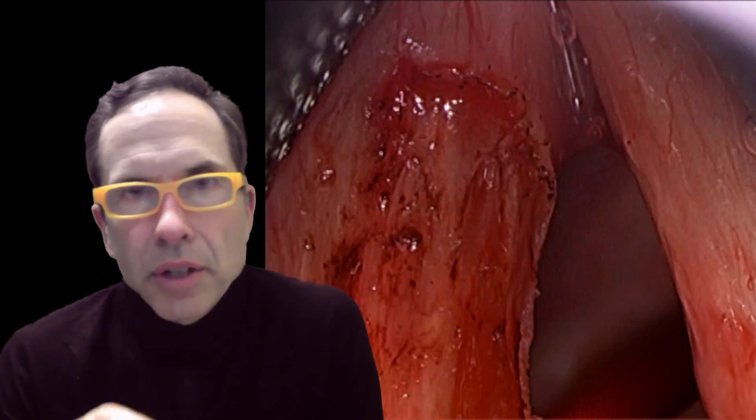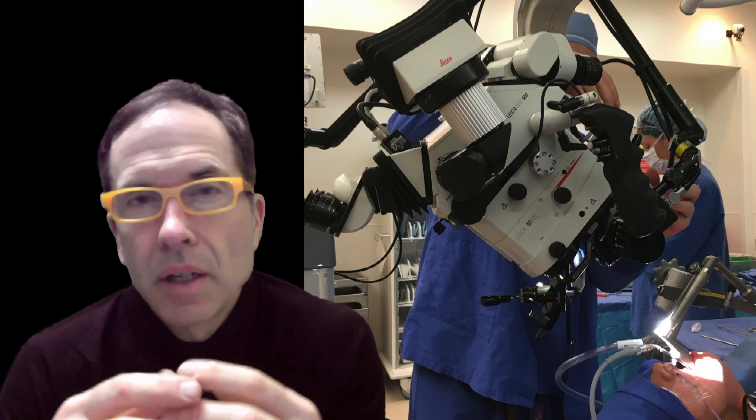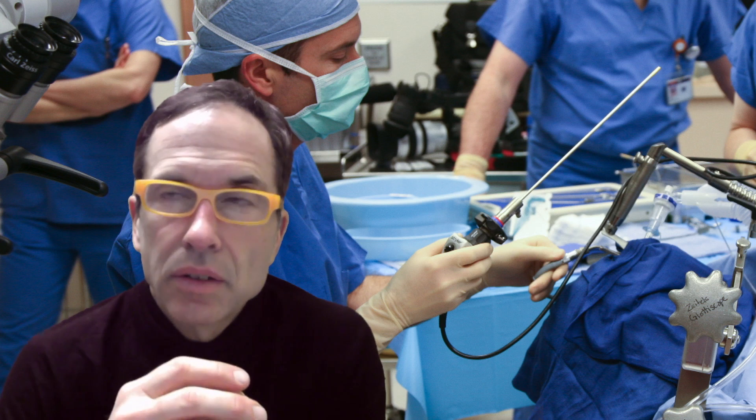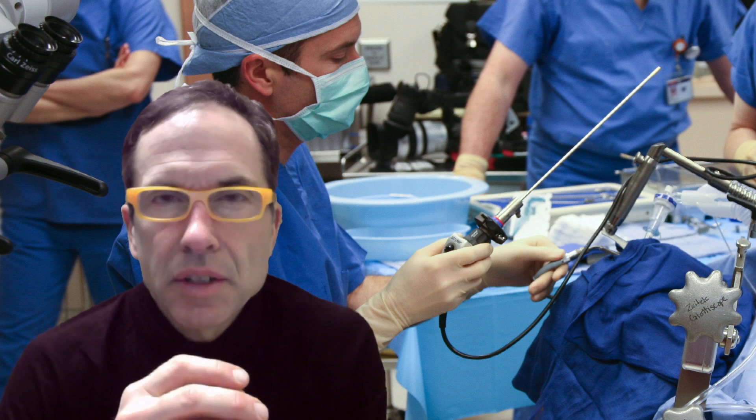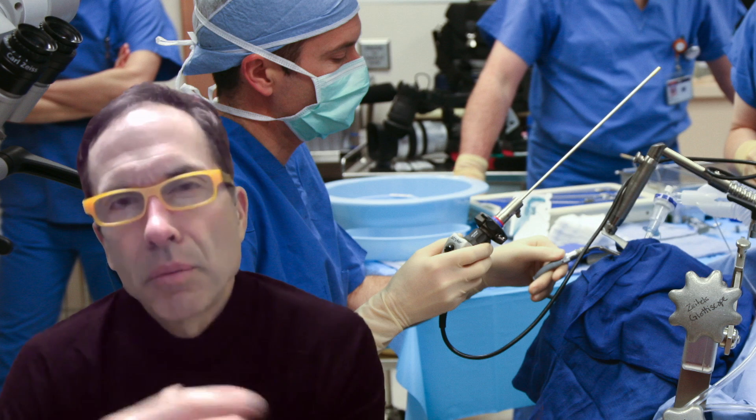After I remove the tumor, I again use the angled endoscopes — particularly the 70 degree endoscope — to get a view of the margin of the vocal cords and look for any potential residual papilloma. Skill in surgery isn't just dependent on your ability to fire the laser, but your ability to perceive things. Equipment has come a long way; I use a microscope and telescopes to visualize the larynx. The second thing, in addition to having good equipment, is recording — because that's how I learn from my mistakes, when I miss something and learn how not to miss it again.